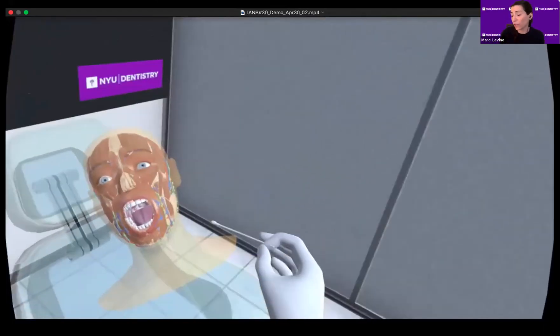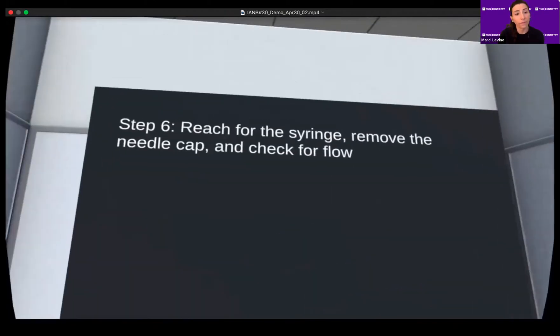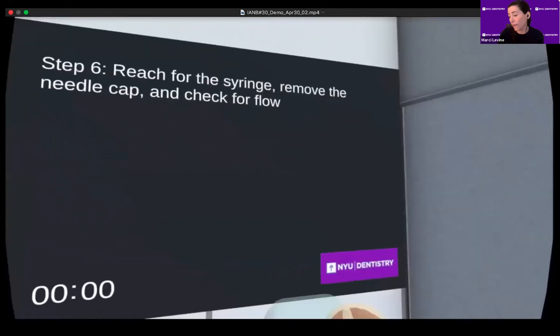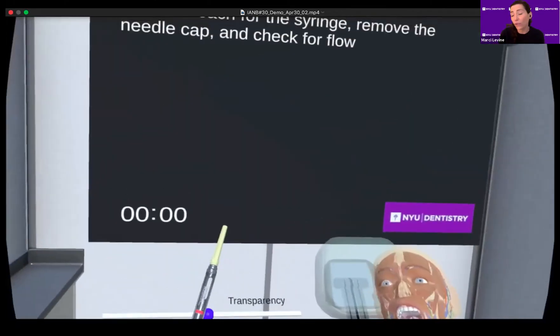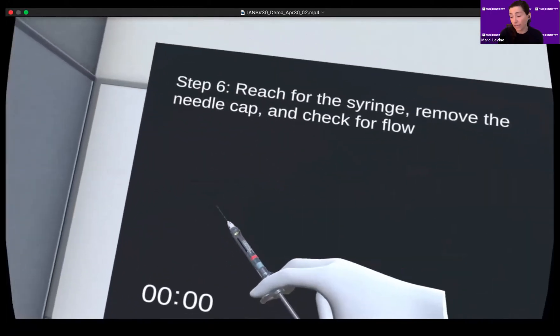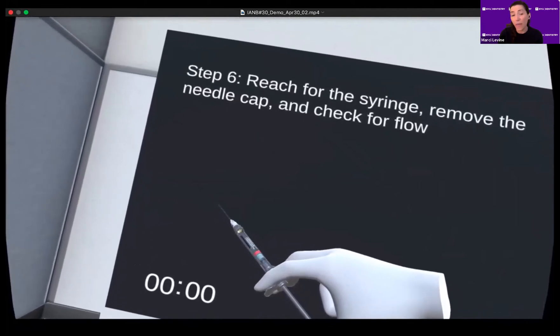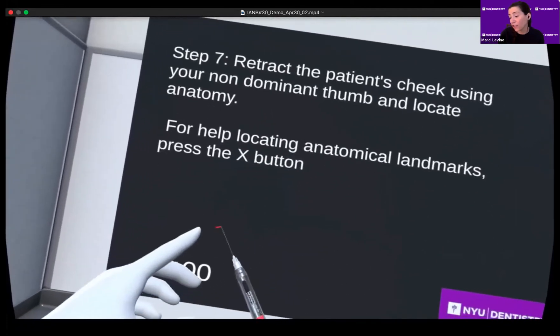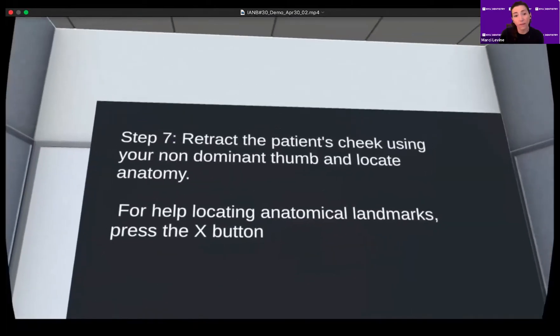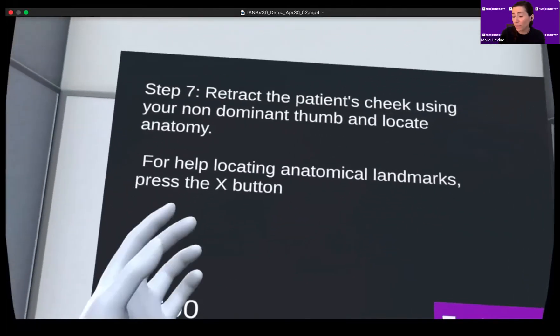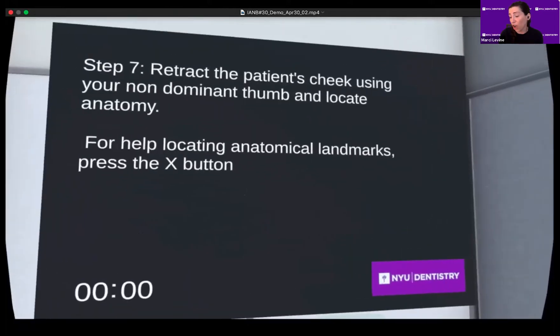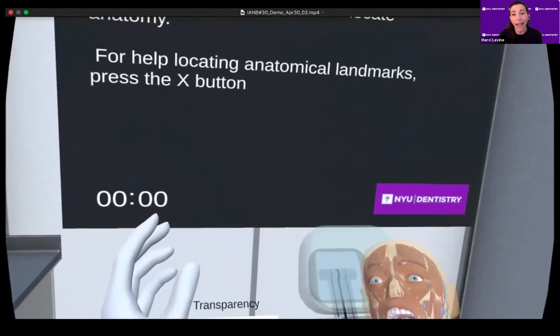As the student approaches the patient, the mouth opens. The next step is to deliver the injection after confirmation of the anatomical structures. The syringe in this module is preassembled so we can focus on the injection — a separate module has been built for assembly and disassembly of the syringe. The cap is removed and the apparatus is checked for flow against a dark background. The bevel of the needle is highlighted in red. Students can use a retractor or tongue depressor, and in this demo they use their non-dominant thumb for palpation and retraction.